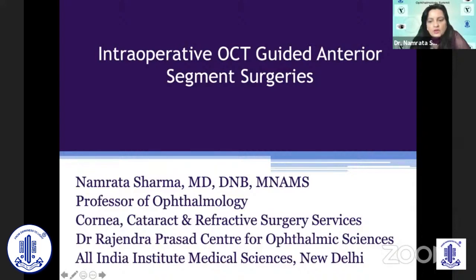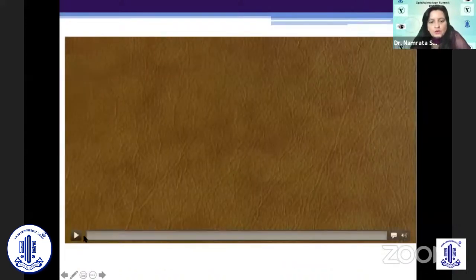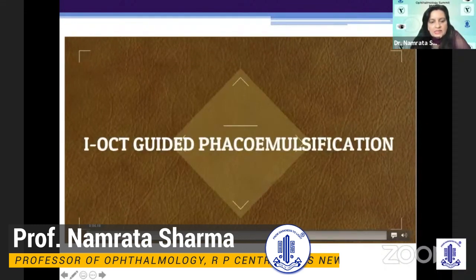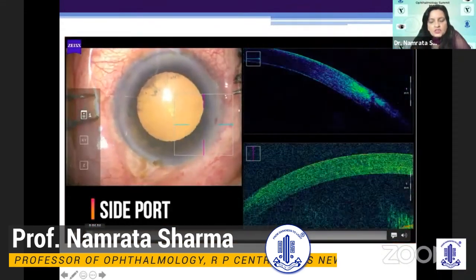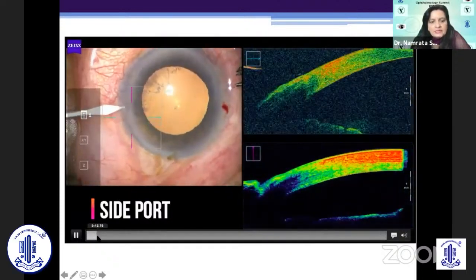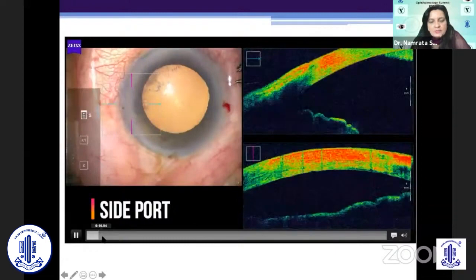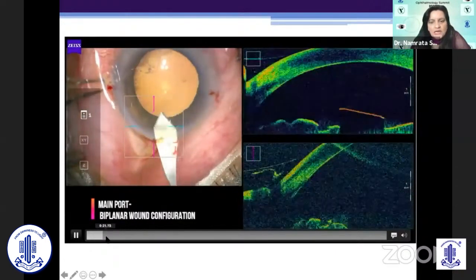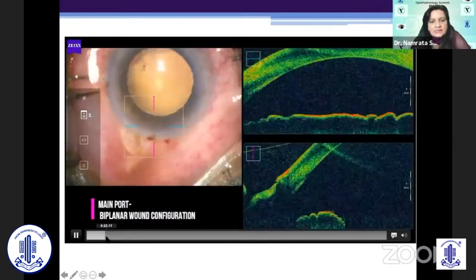And I would like to acknowledge at the outset that Dr. Malugan has done a lot of work and has many award-winning videos on intraoperative OCT in relation to cataract. So, coming to the cataract surgery first, it is a great tool to have in the cataract surgery itself because when you make the incision, you know at what level the side ports are being made and at what level the main port is being made, whether it is uniplanar or whether it is biplanar. So the wound architecture gets better.